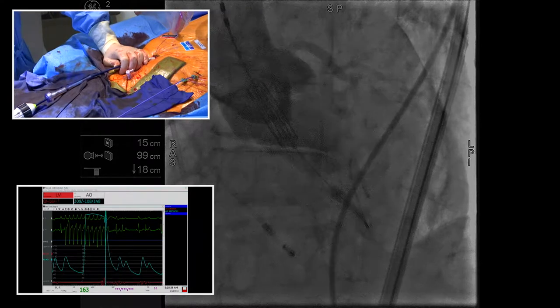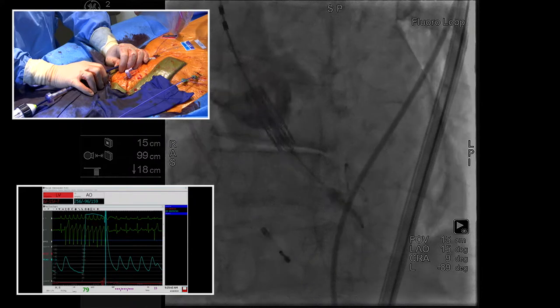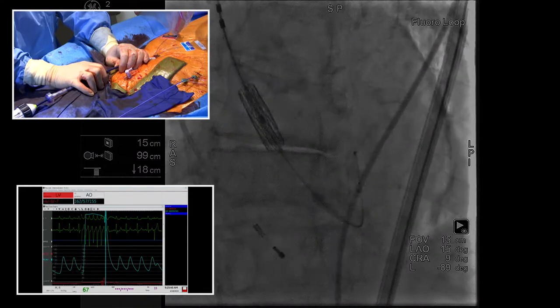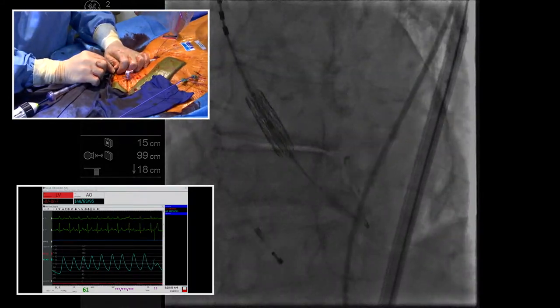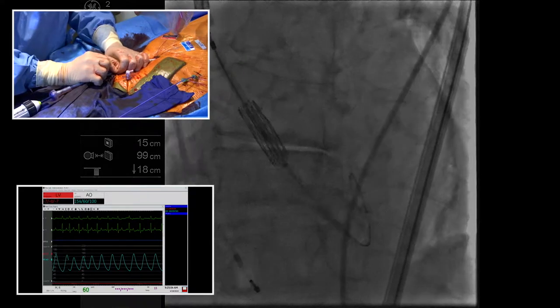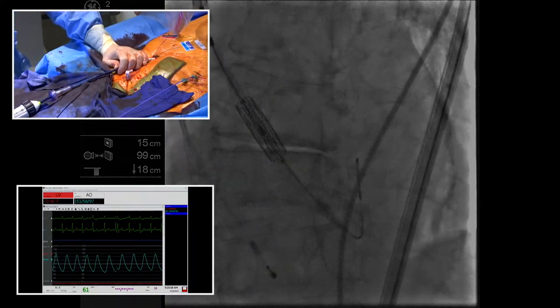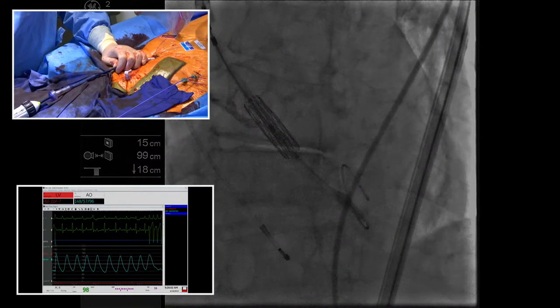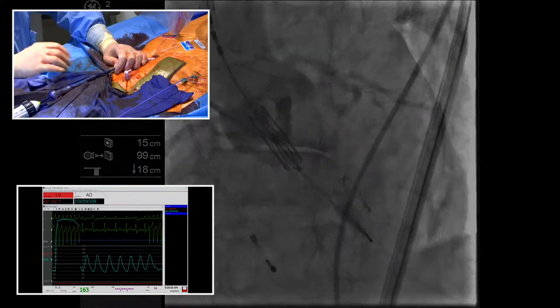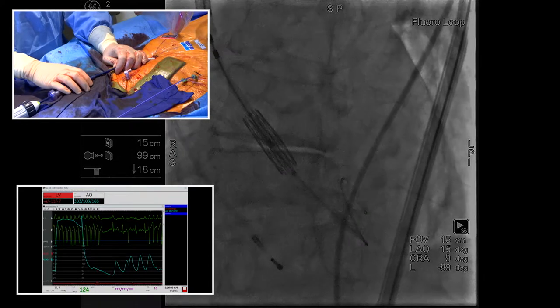That looks like the valve has to go down a little lower, maybe, right? Not too much, though. So the marker should be on the bottom part of the pigtail. It is almost there, but I'm going to push it in a little bit more, right about there. Nice. She's doing great, this patient, so I think we can do one more test. Pacer on. That makes the heart quiver, and I think everyone's liking that. Pacer off, and good. I'll store the fluoro. We all like that? Yeah, looks good.